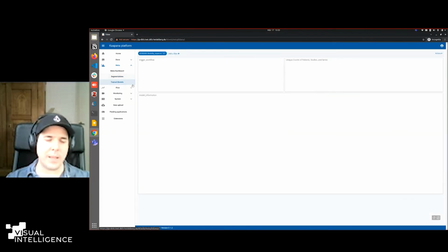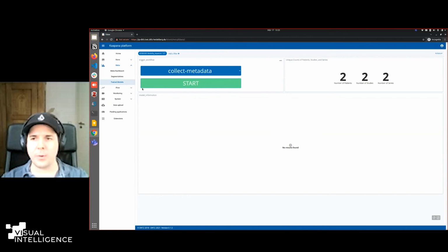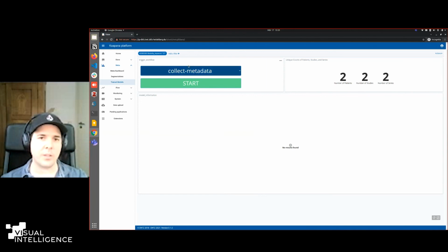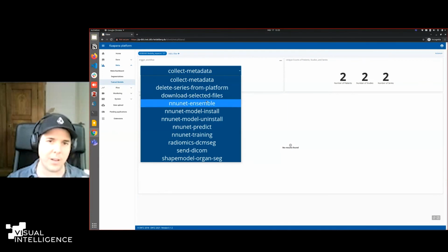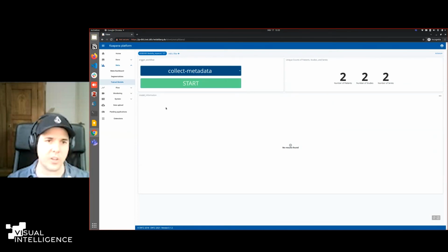The last big dashboard here is about trained models. Just as a small summary, it is also possible to store trained models in the system. We also have some service operators, so we can easily download files or file selections or models as a zip file, or we can just send it to a different instance of such a platform, and they can install it and make predictions with the trained model. So that's in general also possible.